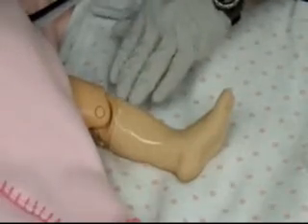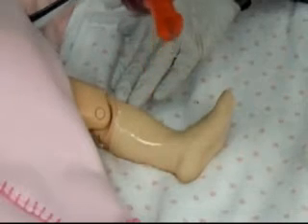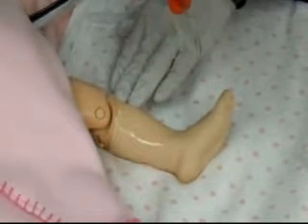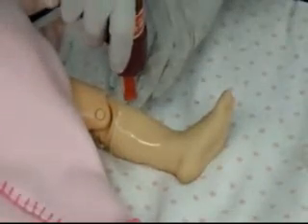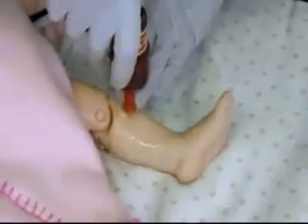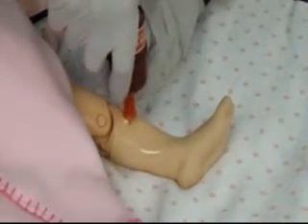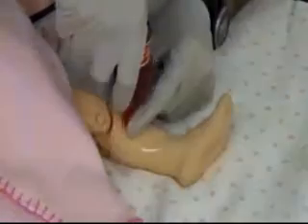Remove the protective sheath. And I don't know if you can see, there's a black line on this needle. When we insert it into the skin, we need to make sure that we can still see the black line prior to drilling. Come into our site at a 90-degree angle, insert, make sure that we can still see the black line, and then drill and slowly insert the needle.